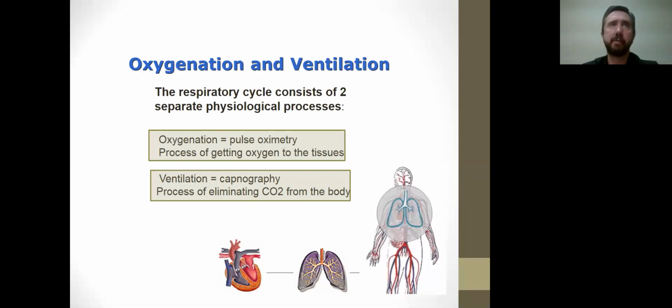Now, ventilation, on the other hand, is simply the mechanics of the movement of air. It's how we get rid of carbon dioxide. Carbon dioxide is carried back through the blood and exhaled by the lungs through the alveoli. Capnography is measuring the ventilation aspect of this process.